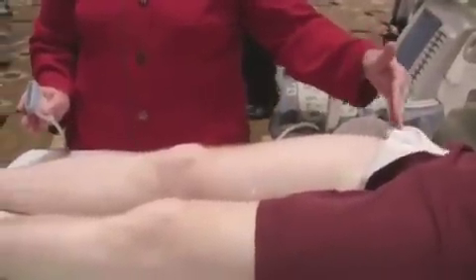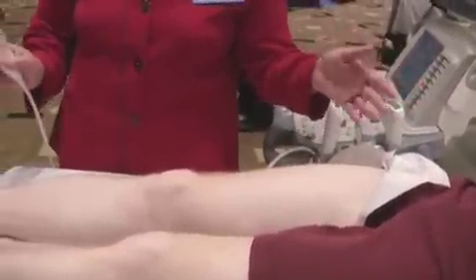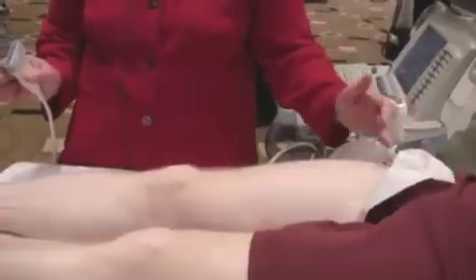So, to recap, we've taken you through the lower extremity arterial duplex. We started up here at the common femoral artery, and as I said, if that's all nice and normal, we're good here. If it's not, then we'd want to go further north and look at the iliacs and even the aorta. But that's not routinely done in some labs. Some labs do the whole thing. That's a matter of your preference.